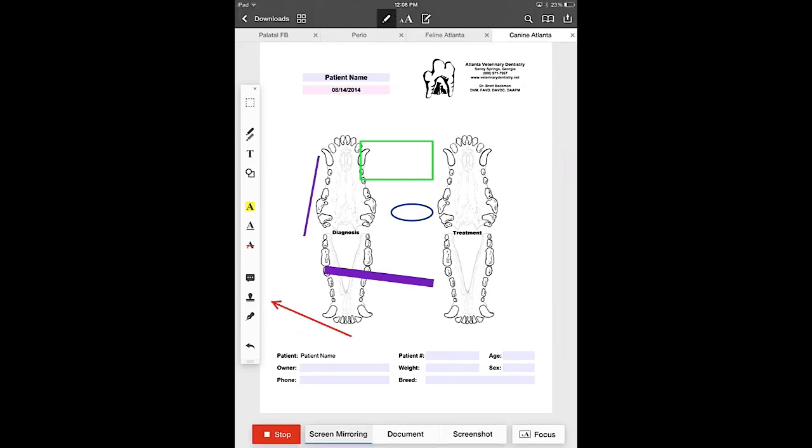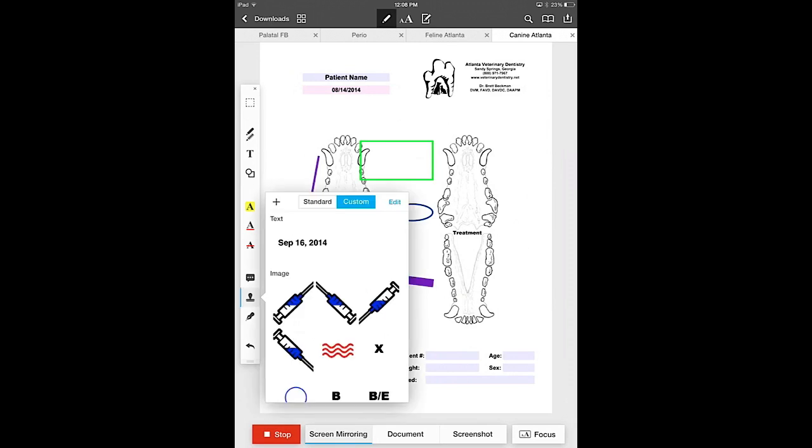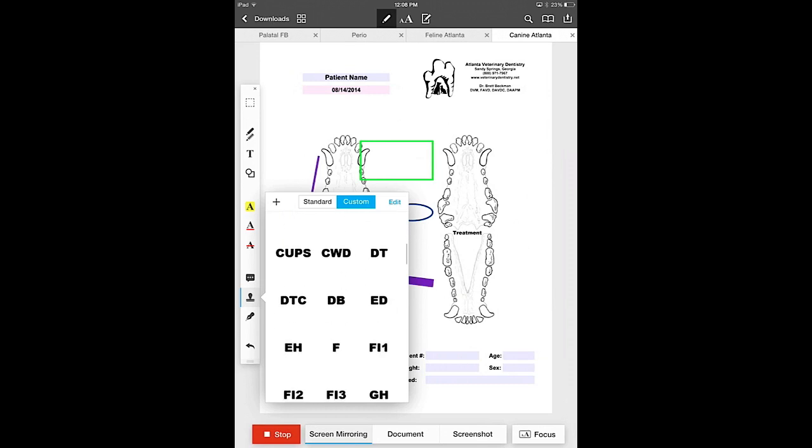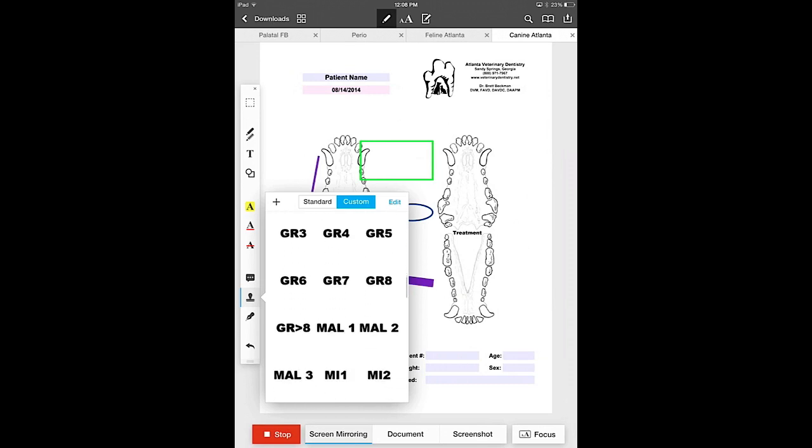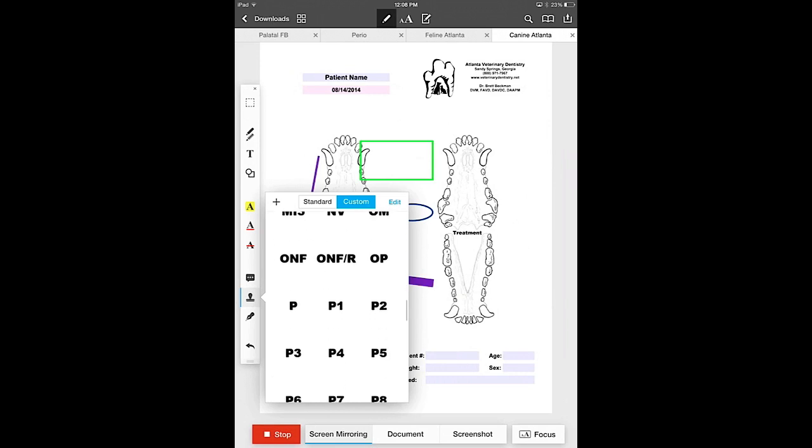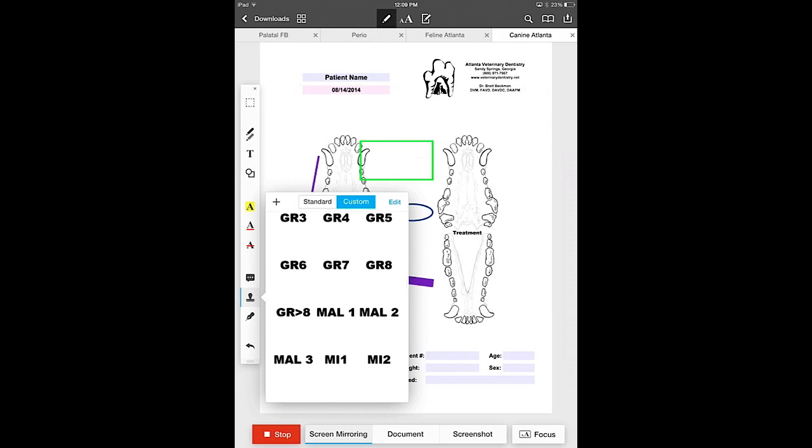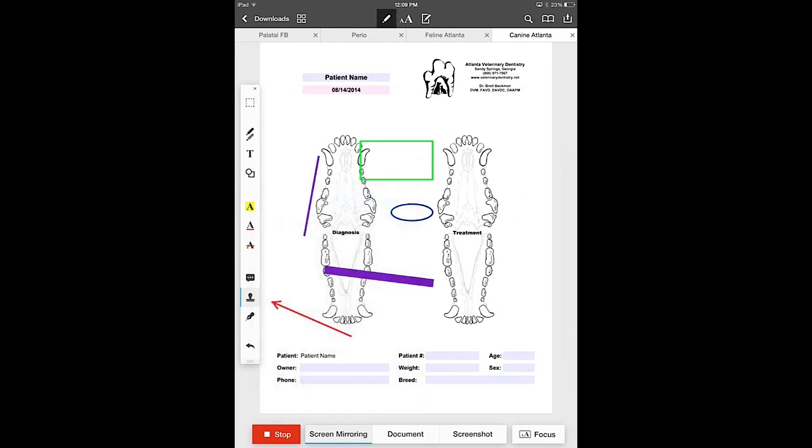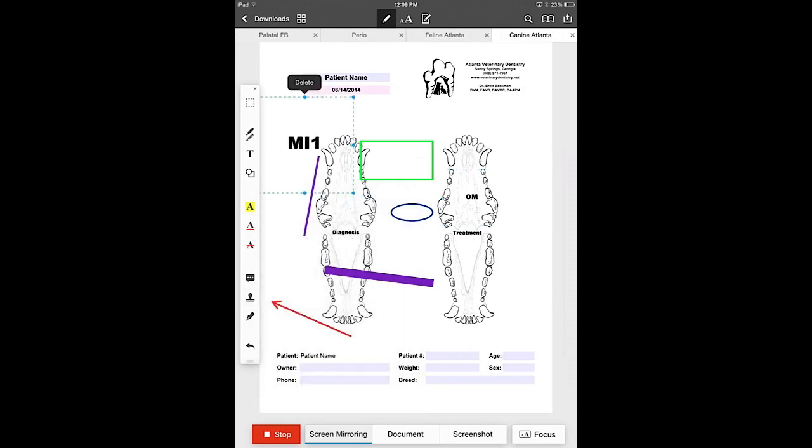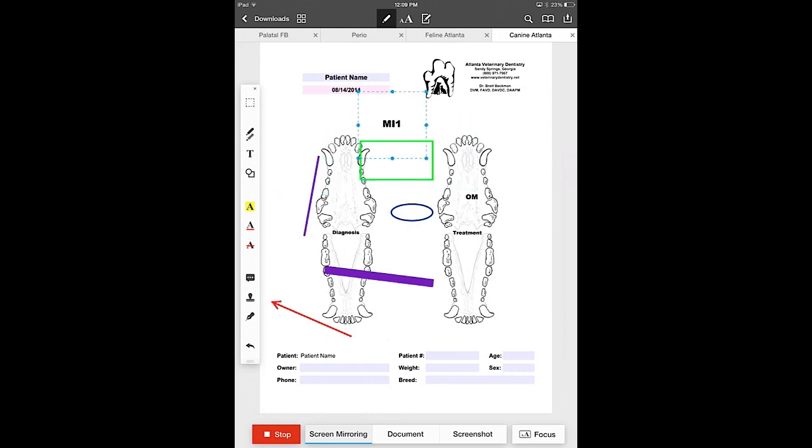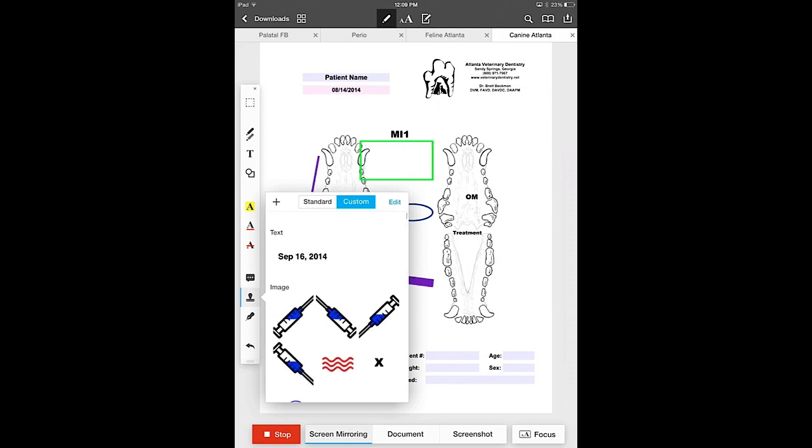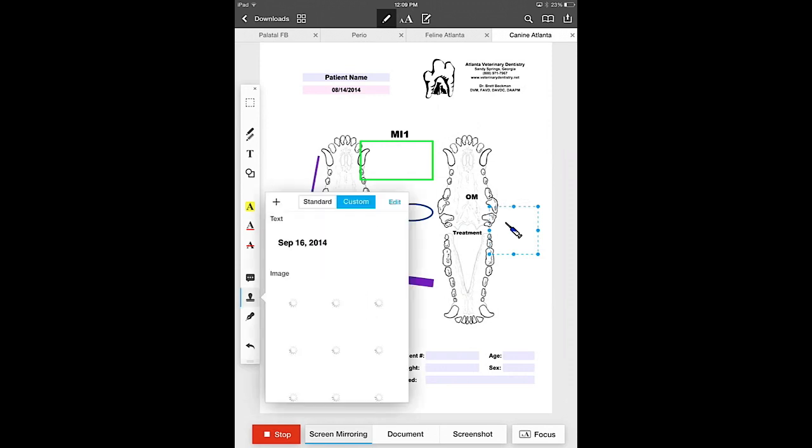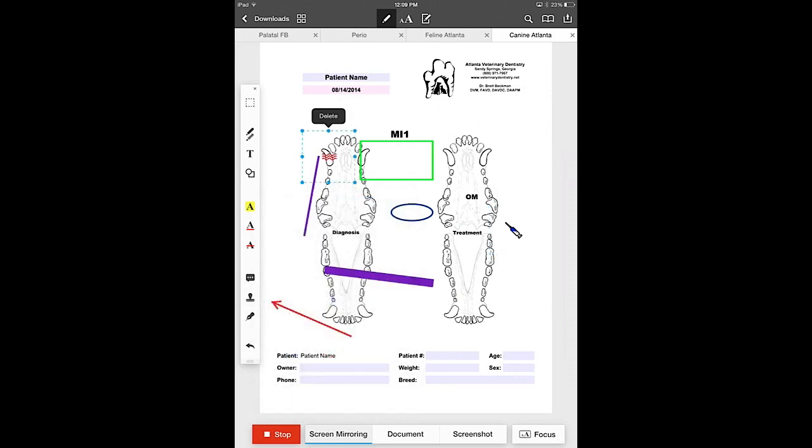This is the image stamp which we've already loaded over a hundred abbreviations that are all American Veterinary Dental College abbreviations, spare a few which the college does not have, and these are the most common abbreviations that we use every day. So all we do when we're utilizing the image stamps is we tap on the image stamp and we tap on the page and those automatically come up. We can resize those, we can move them around as we wish. It's very hyper functional and very quick to utilize these. We've got the nerve block symbol there and various annotations, one for fracture that we use. So those are probably the most commonly used under that icon of anything that we have on the annotations function.